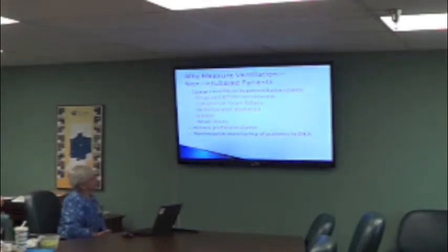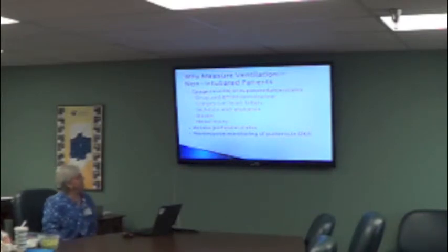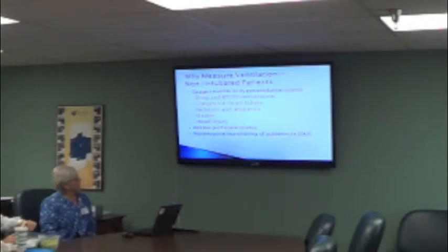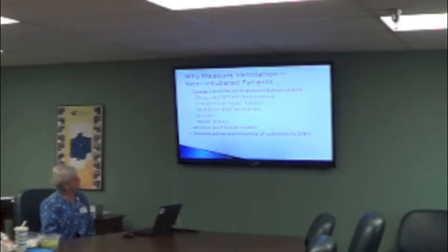And why measure ventilation in non-intubated patients? The main reason that we would use the cannula and have an idea about the CO2 is if somebody is hypoventilating, whether that's drug-induced or the conscious sedation, PCA pump, anything that we're giving a medicine that could cause the patient to hypoventilate or breathe shallow or less breaths, or if it's a drug or an alcohol problem.